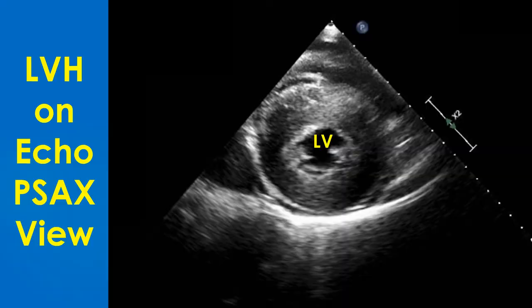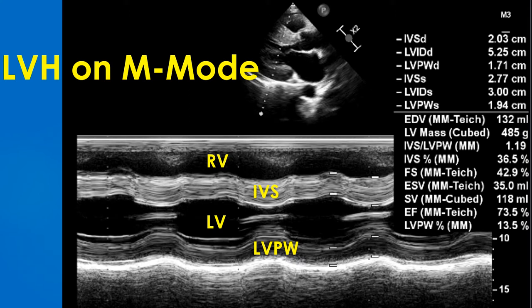Parasternal short axis view at the level of the papillary muscles showing severe concentric left ventricular hypertrophy. Serial short axis views have to be obtained and maximal thickness documented when assessing hypertrophic cardiomyopathy for risk profile.